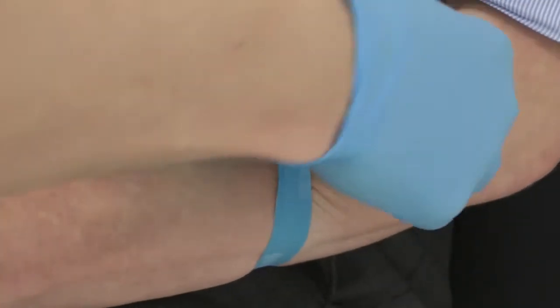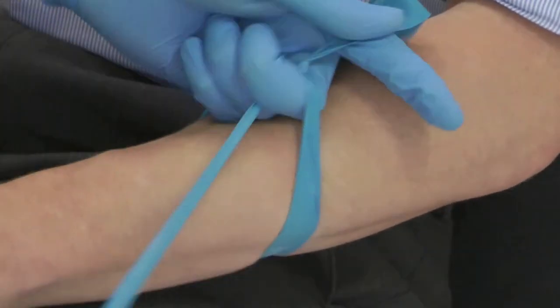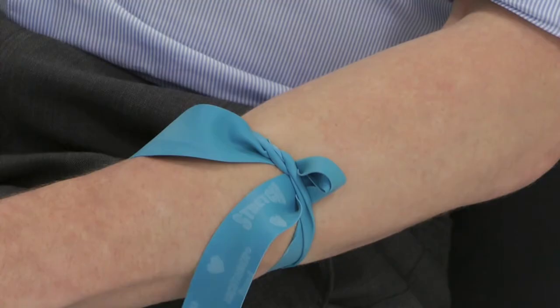Cross the ends over, holding one end between the thumb and index finger. Wrap the other end around your middle finger. Lifting the tourniquet away from the arm, push a loop through with your middle finger. To release, simply pull the looped end.